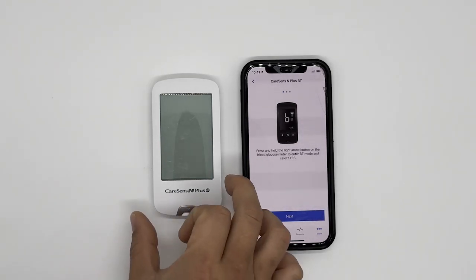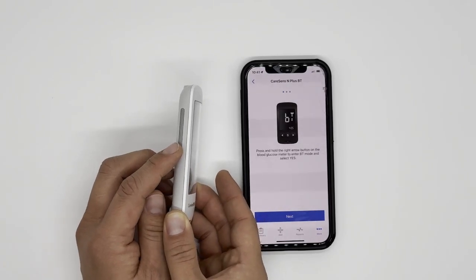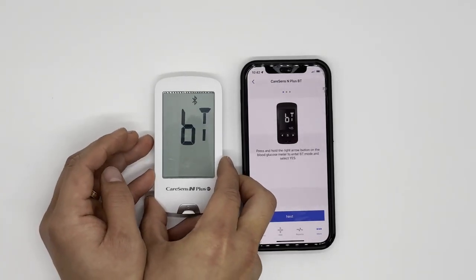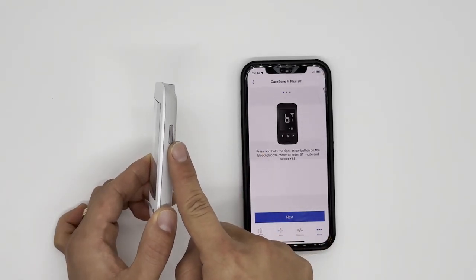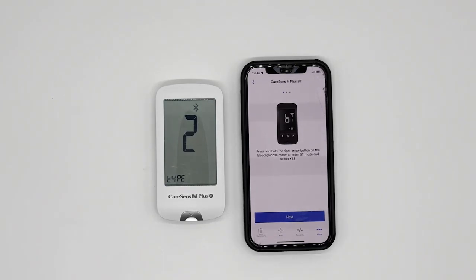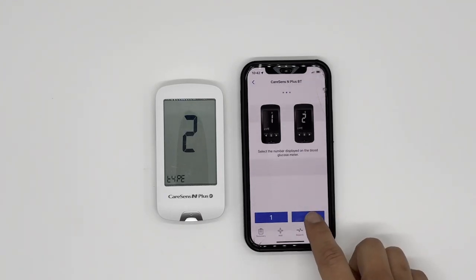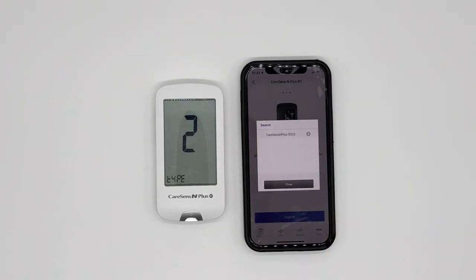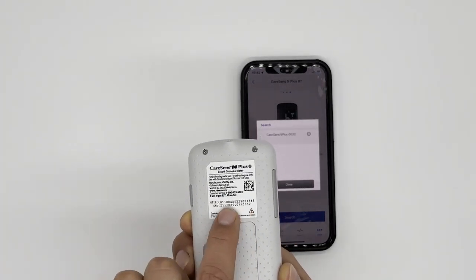From this screen, go to your meter. There is a down arrow button on the left-hand side. Press and hold that button for three seconds, and you will see a screen on your meter showing BT and Yes blinking. When you see Yes blinking, there is a button on the right — I'll call that the power button. Click the power button once, and then you'll see the number two on your meter. On your phone, go to Next, choose two, and then press Search. You'll see CareSense N Plus followed by four digits.